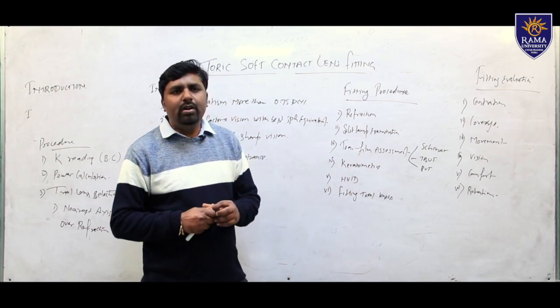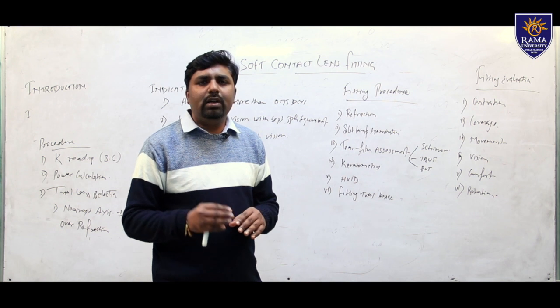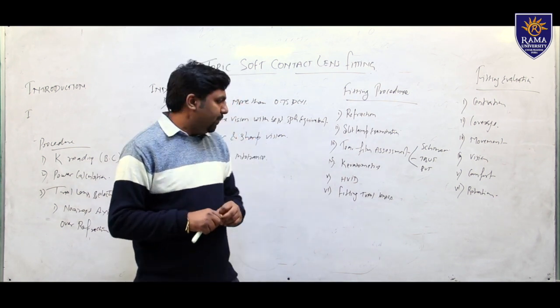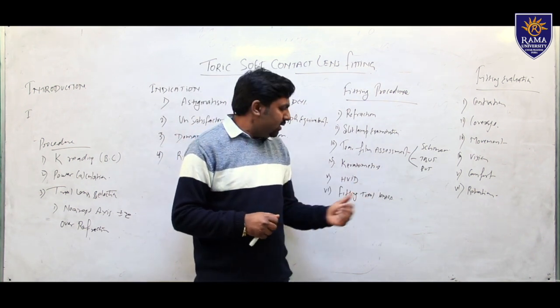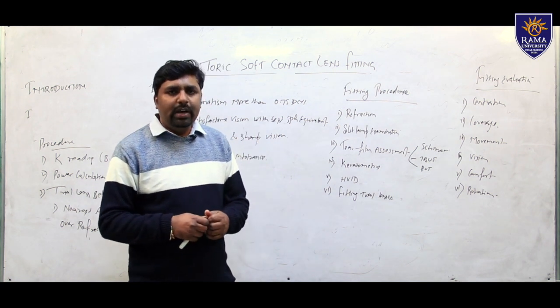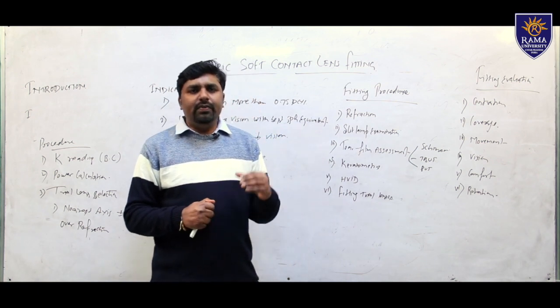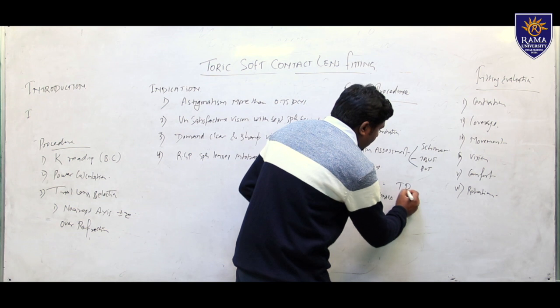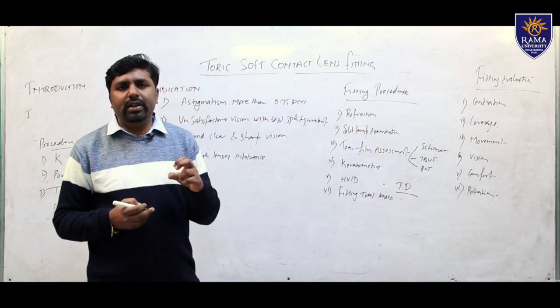Keratometry: we have to perform keratometry to find out the base curve, because the base curve is required to fit contact lenses. Then HVID. HVID is nothing else but the horizontal visible iris diameter. We have to measure this with a scale. HVID gives the diameter required for the contact lenses, that is, how large a contact lens we require.